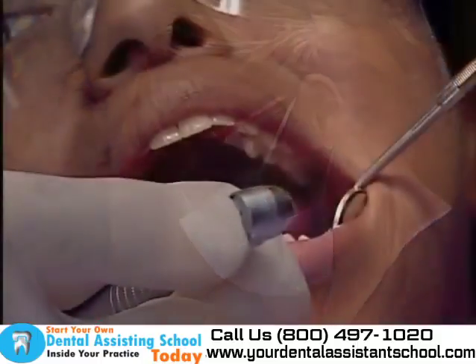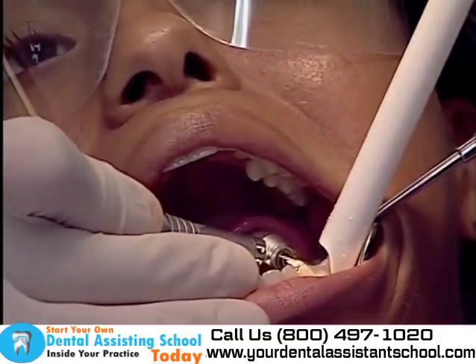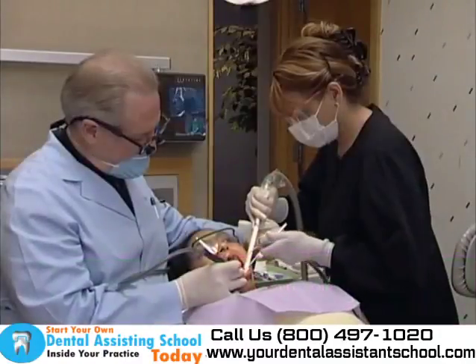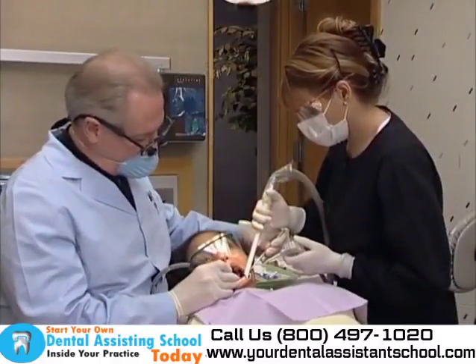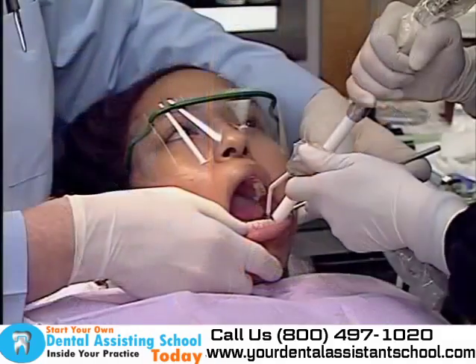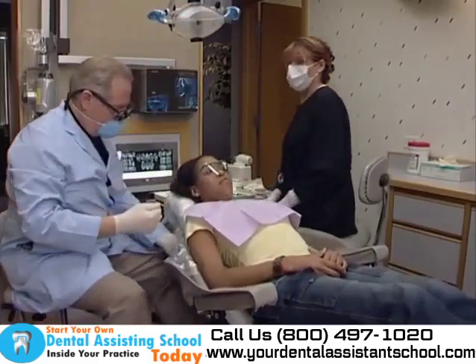Typically, the dentist utilizes several different handpiece attachments when finishing and polishing a composite. A finishing burr is attached to trim and polish the composite. A finishing strip is used, which utilizes sandpaper to smooth the sides of the composite. Stones may be attached for finishing, and composite finishing points or discs may be used for polishing. The dental assistant should be aware of the dentist's preference in handpiece attachments, but also be ready when asked for a particular instrument. Once complete, the assistant uses the air-water syringe and HVE to remove any other debris and leave the patient with a clean mouth. The light is moved away from the patient's face and the assistant hands the patient a mirror to view the new restoration.